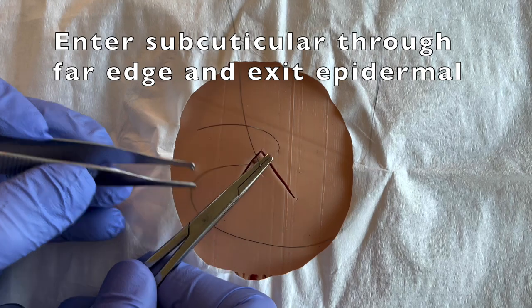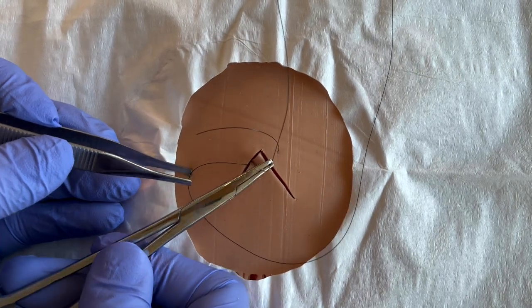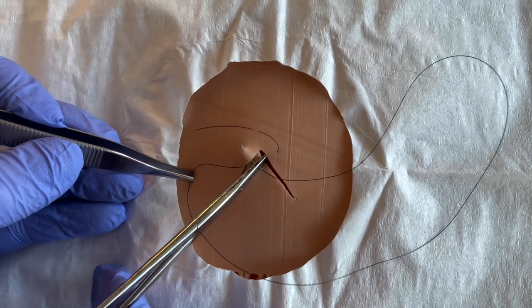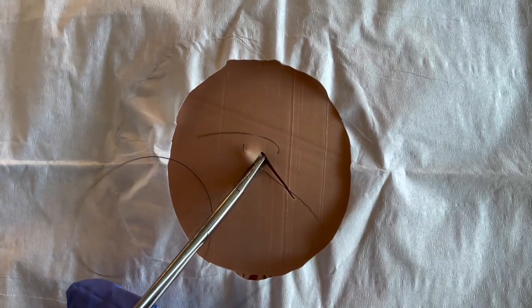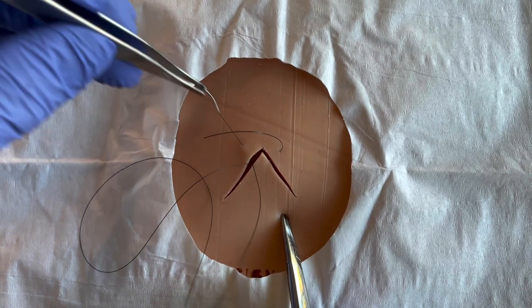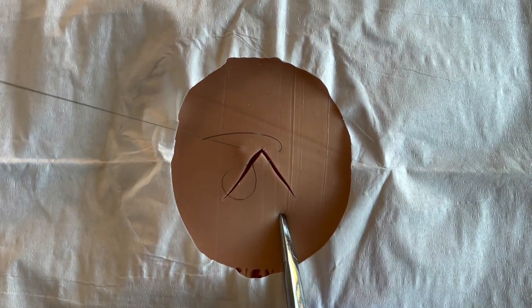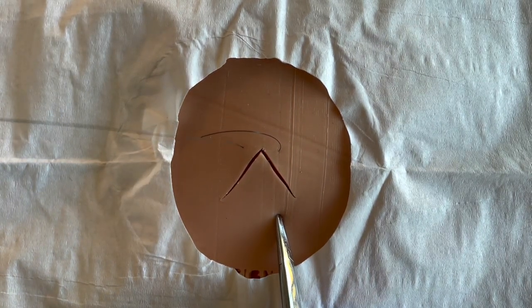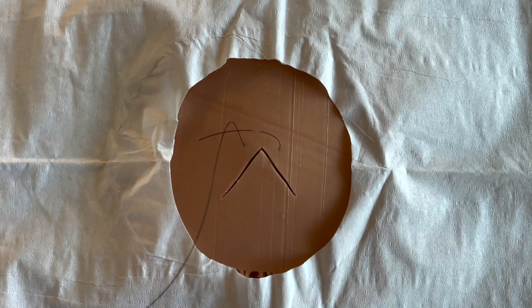Again, be mindful to stay in the same plane with your entry point subcuticular as you were for that subcuticular throw through the flap. You'll exit such that your exit point is directly across from your very first entry point.